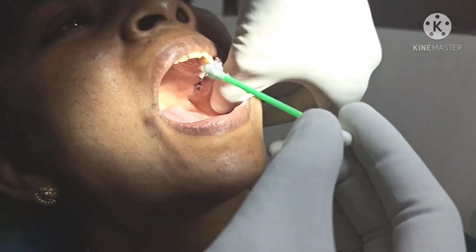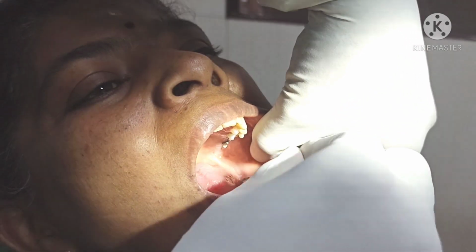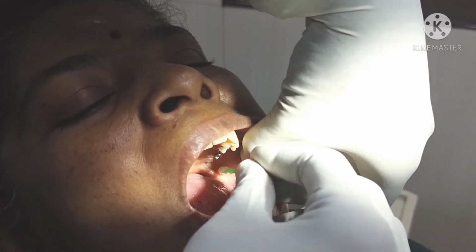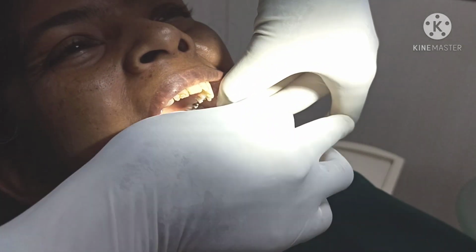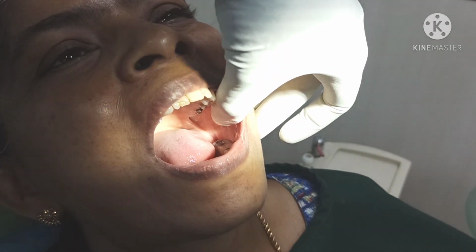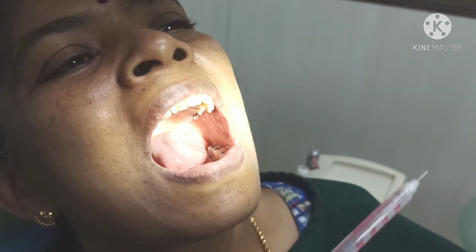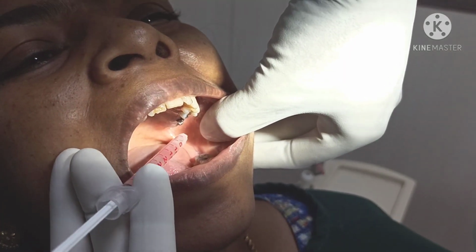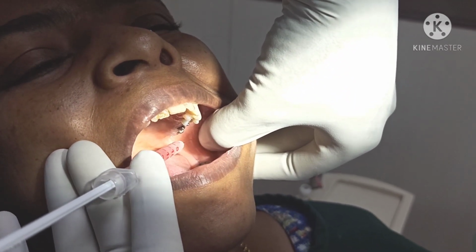To make the block comfortable, we are applying topical gel. If you are going to give a long buccal block also, apply topical anesthetic gel over that area. Ask the patient to close the mouth. Always wait for 60 seconds for the topical anesthetic gel to work. Then this is the entry point, anterior to the pterygomandibular raphe, above the occlusion plane.